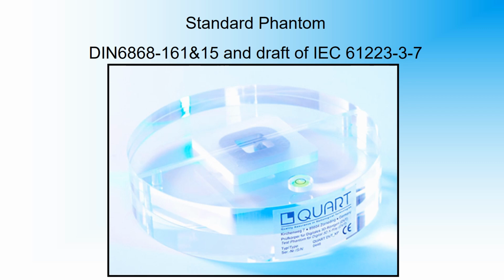The Phantom itself has been present for quite a while. It was established with a German standard for dental cone beam CT about 8 years ago, and has been present internationally since the standard was translated by us. Additionally, there's a draft of an IEC standard for dental cone beam CT that adopts the same Phantom, and we have had different collaborations where it was used on other kinds of devices.